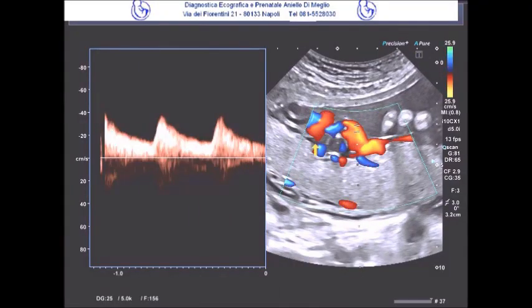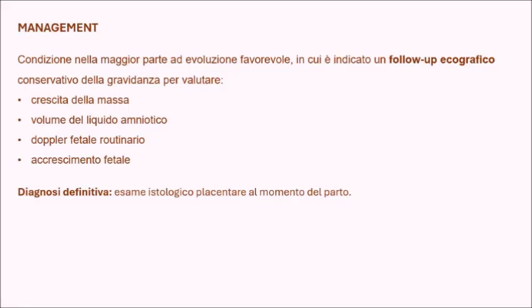The patient also underwent an MRI scan. Here we can observe the mass, and first of all, how its size is essentially consistent with what was detected in the previous ultrasound study, but above all, how its nature also appears remarkably heterogeneous in its composition here, which further supports the diagnostic hypothesis of a teratoma. Therefore, we were highly optimistic and encouraged with the patient, since this is a medical condition that in the vast majority of cases is associated with a very positive and favorable outcome.